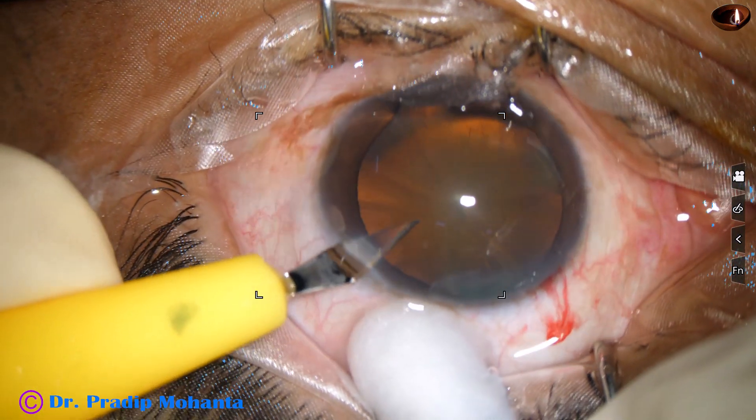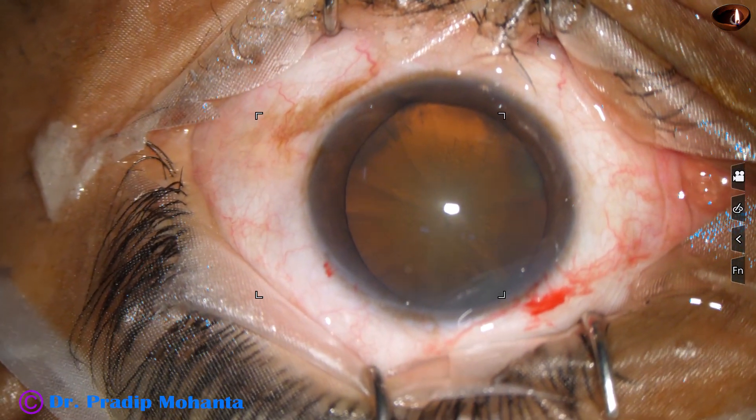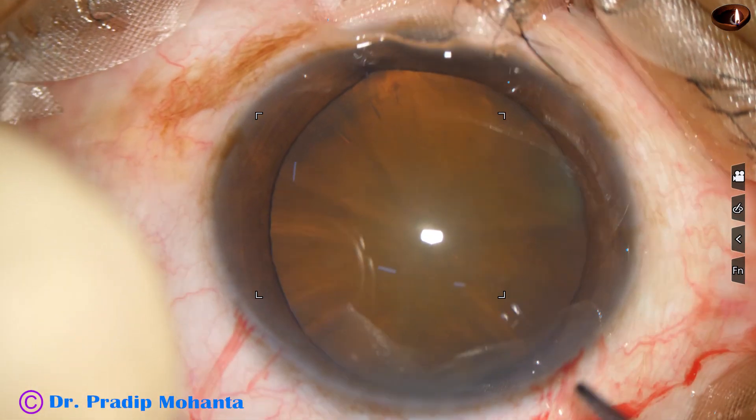This is a side port on the left side of the main incision, about 3 o'clock hours away. And now it is time to do capsulorhexis.